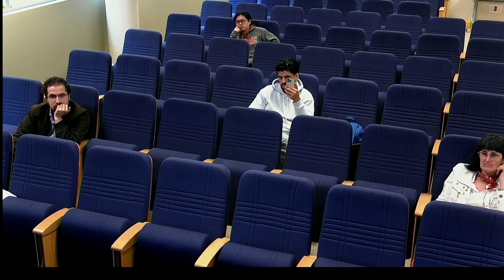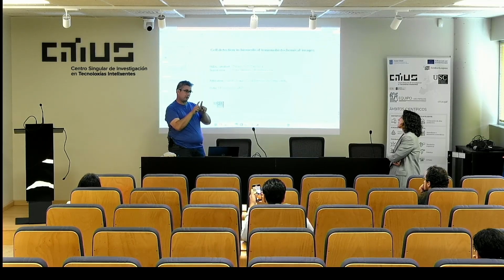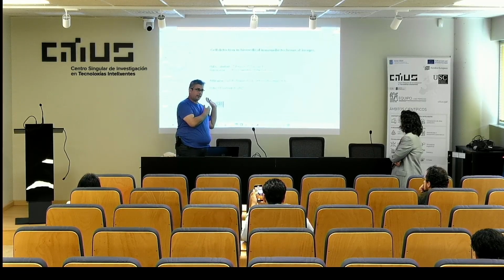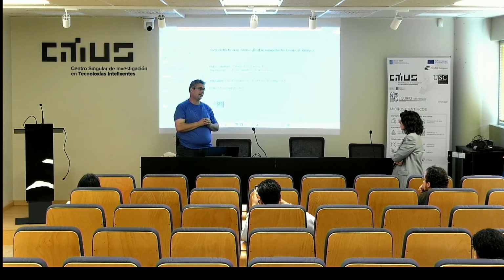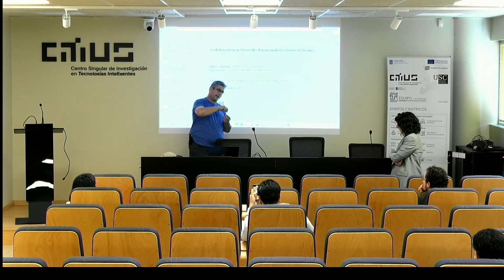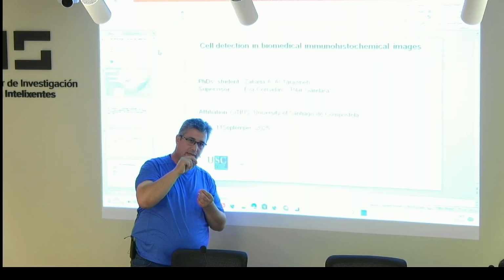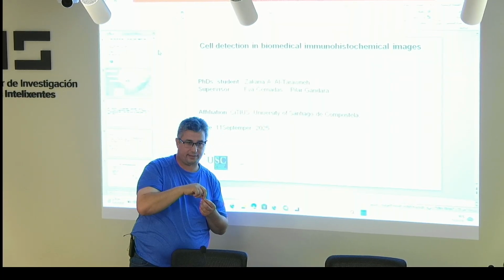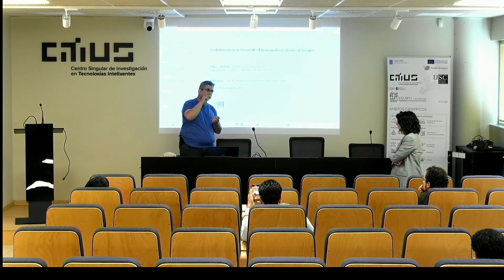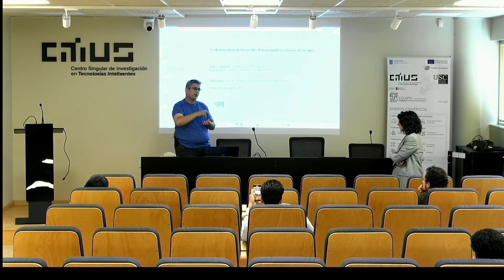In the other model, YOLO, we use the bounding box, which is only 11 by 11. For example, the original diameter is 20 by 20 for the cells, but we have 11 by 11 because we are concerned with the centroid of the cells. We depend on the centroid of the cells in both techniques to select them.